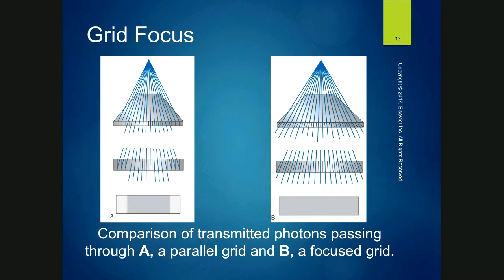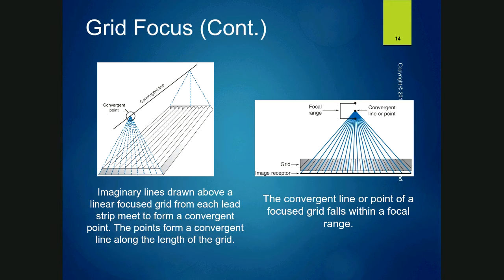That being said, with a focus grid, you have what I would call a sweet spot where this is more ideal. We have a sweet spot where our ideal range is.